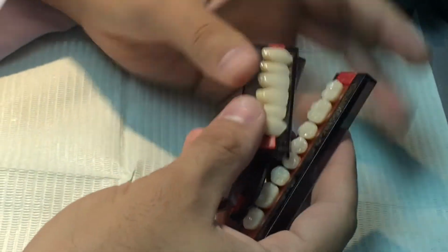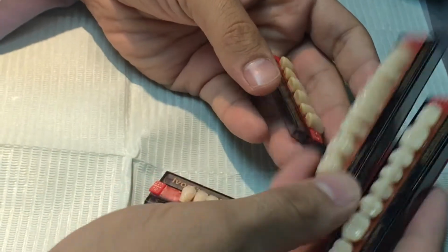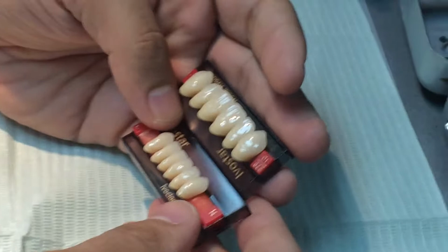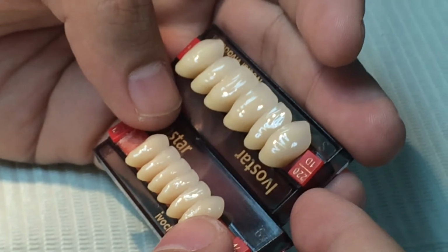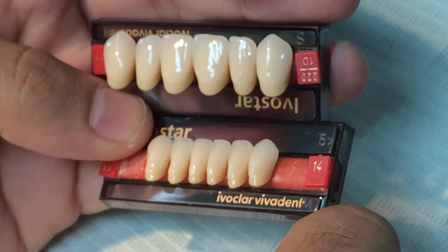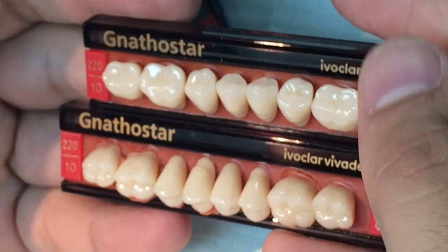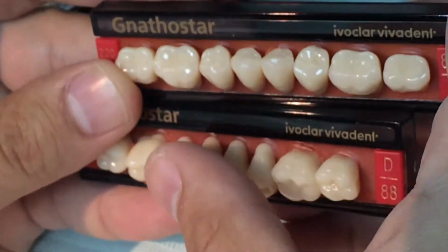So these I think are mixed up for you now, and for the anterior and posterior it's easy to find, right? I can say that this is posterior and these are anterior. But where is the upper and where is the lower? You can see here the upper and lower, it's easy to find, right? So this is the upper teeth and this is the lower teeth. But if we go to the posterior, it may be harder for some people. So where is the upper and where is the lower? This is the lower teeth and this is the upper teeth.